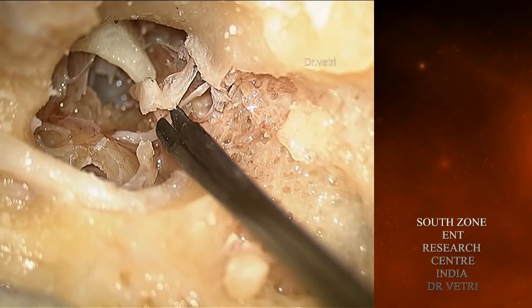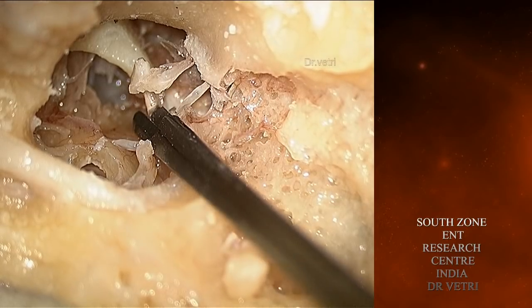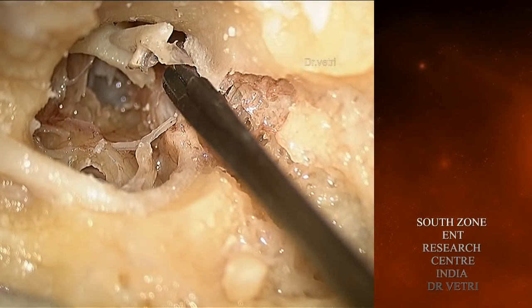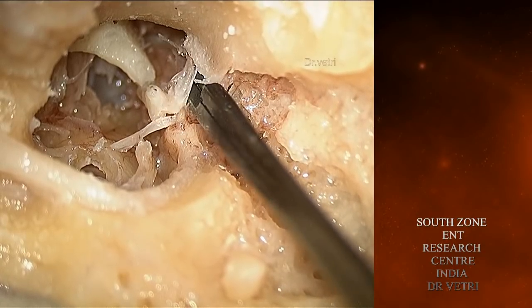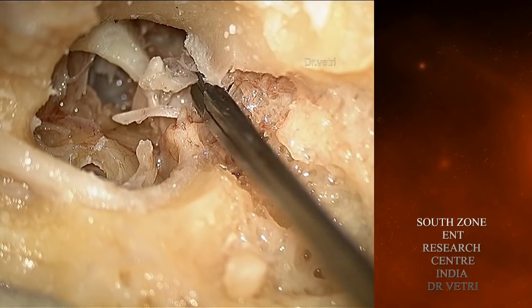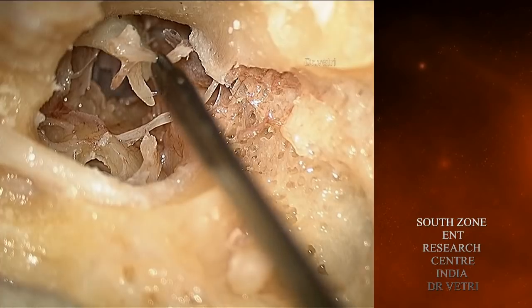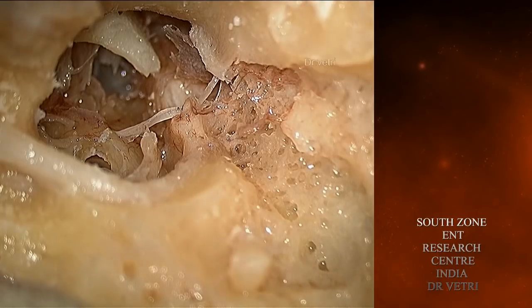You can see the entry point of the chorda tympani. The anterior wall has three openings: one for the chorda tympani, one for the anterior tympanic artery, and the attachment of the anterior ligament of the malleus. The chorda tympani enters the canal of Huguier. Still part of the outer attic wall anteriorly is hindering the view of the canal of Huguier. The anterior ligament of the malleus has now been cut — see how firm it is.